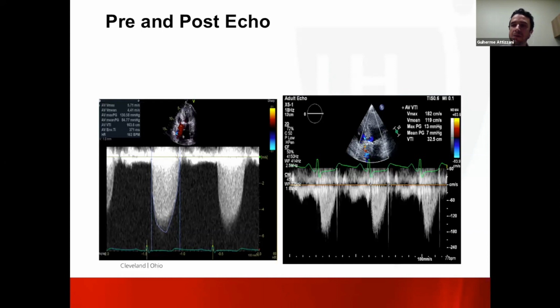And this is something that we do. We can customize this per patient's anatomical features. But in this patient, I really don't have significant concerns. She has very wide anatomy, wide sinus, wide STJ, and takeoff of the coronary. So I wouldn't be significantly concerned.